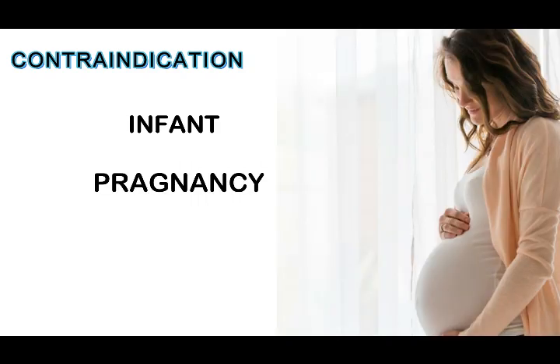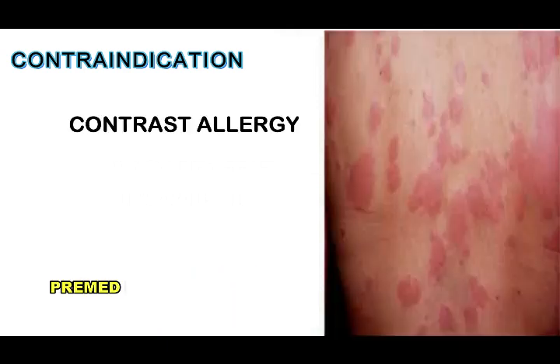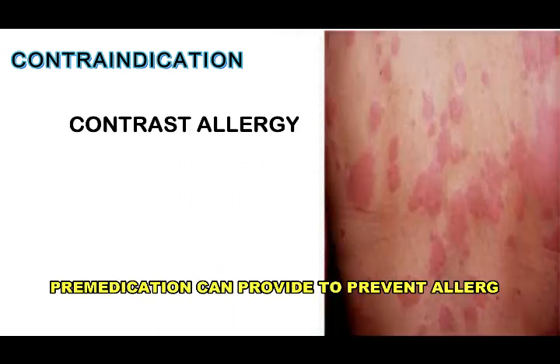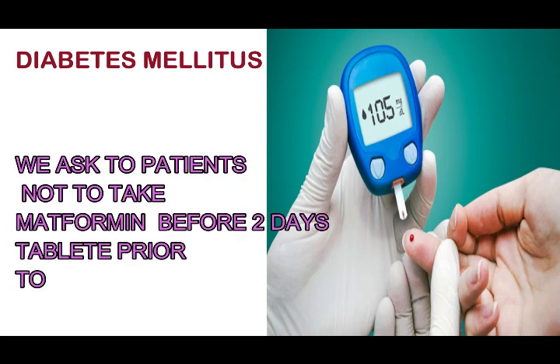Pregnancy is contraindicated for this procedure, and we can apply the 10-day rule here. Contrast allergy history is contraindicated for this procedure. We can provide pre-medication to the patient to prevent it. If the patient has a diabetic history, we ask the patient not to take metformin for 2 days prior to the examination.